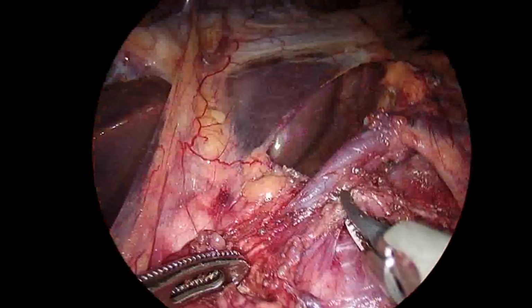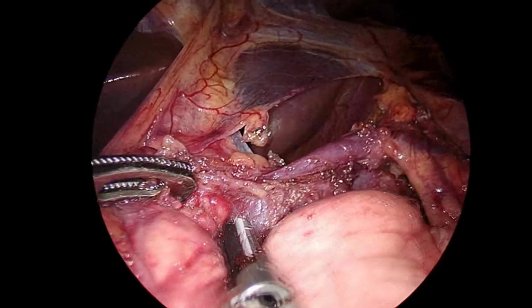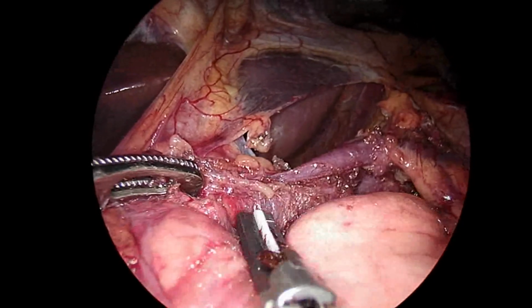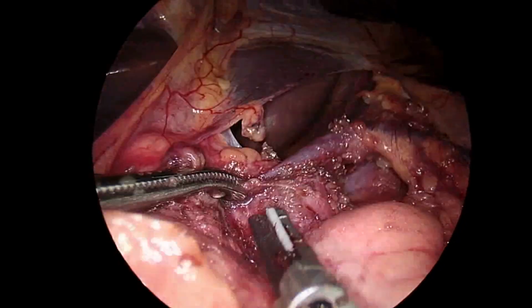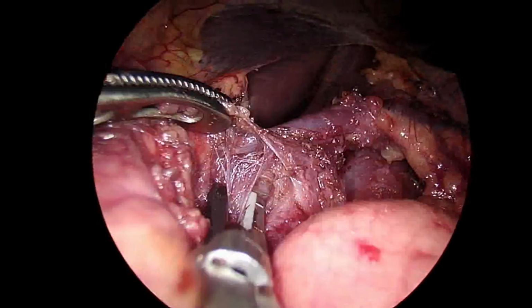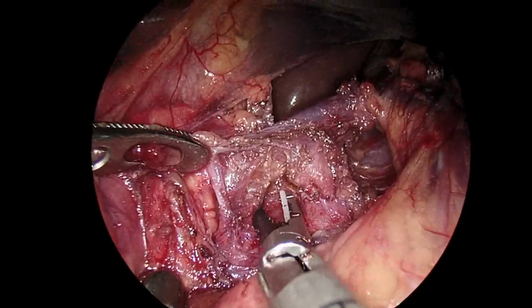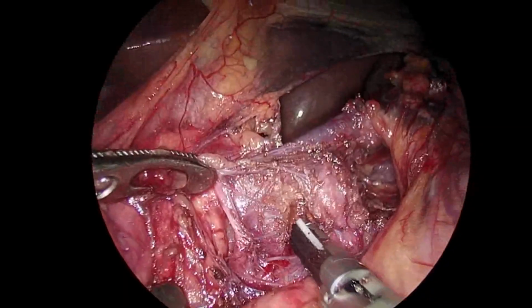And now dissecting the crural fibers to identify the aorta and to go to the origin of the celiac. All this tough fibrotic tissue was excised, initially incised with ultrasonic scissors. One can use either LigaSure or ultrasonic.